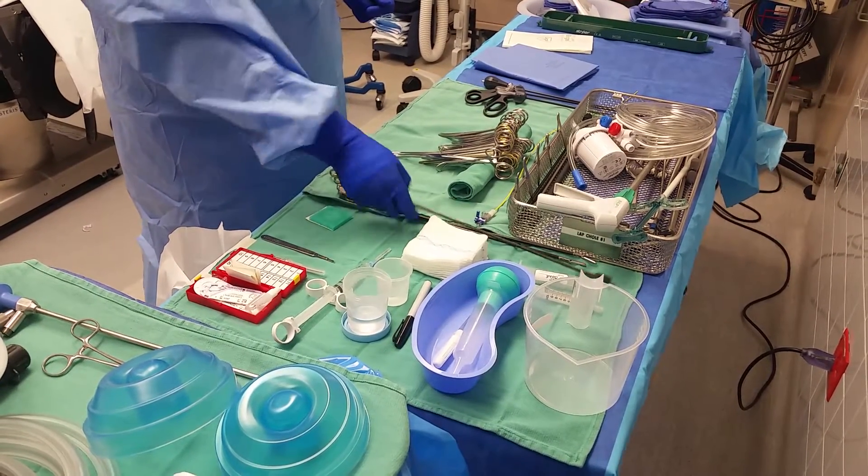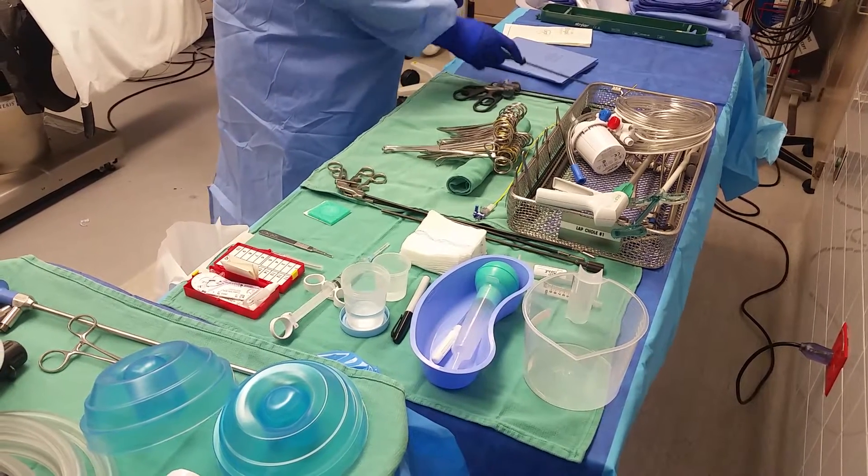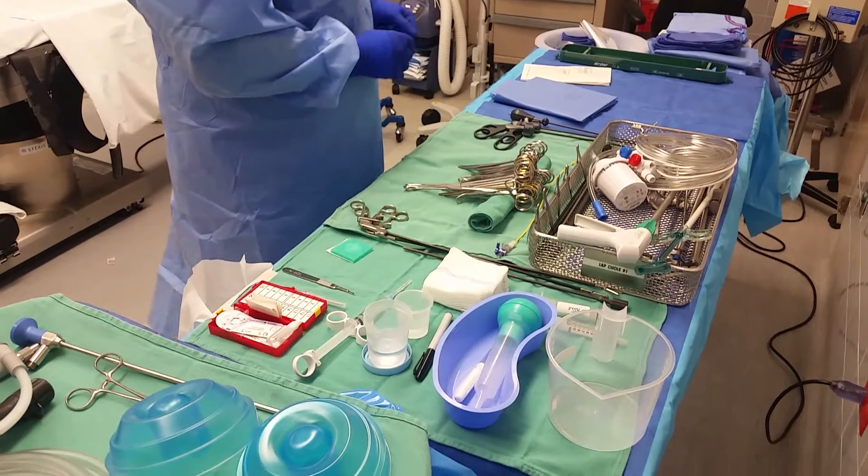My two graspers, suction tip, scissors, grasping forceps, and the hook that he's actually going to use to dissect the gallbladder from the liver.